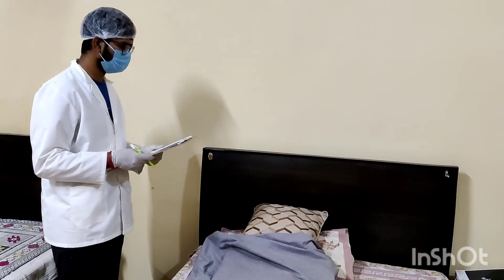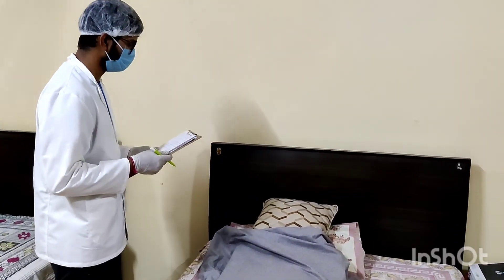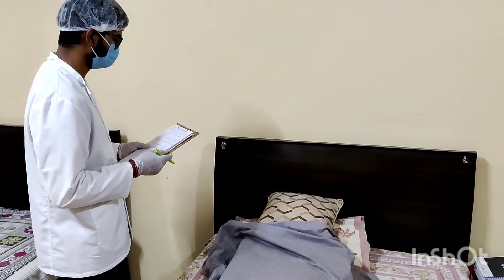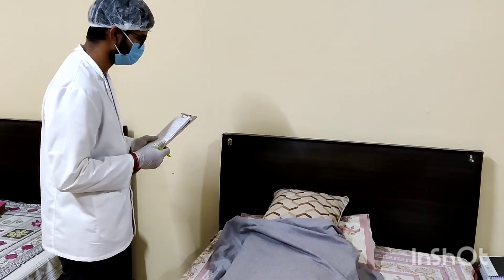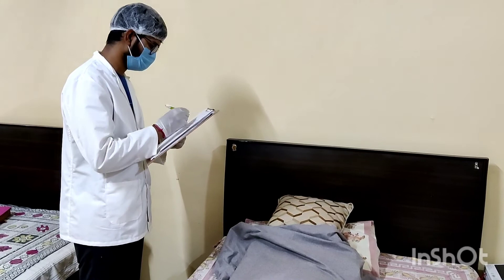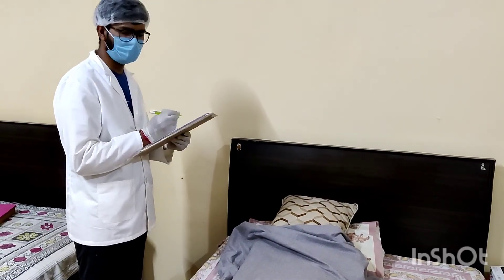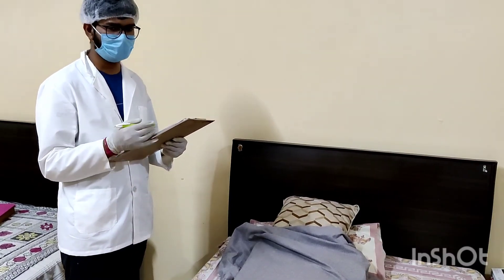The patient is on an indwelling catheter and I am going to check on you if you have any problems with the catheter. First of all, do you feel any pain or infiltration during micturition? Do you feel any burning sensation when urinating? If the patient feels any burning sensation, report it to the nurse.